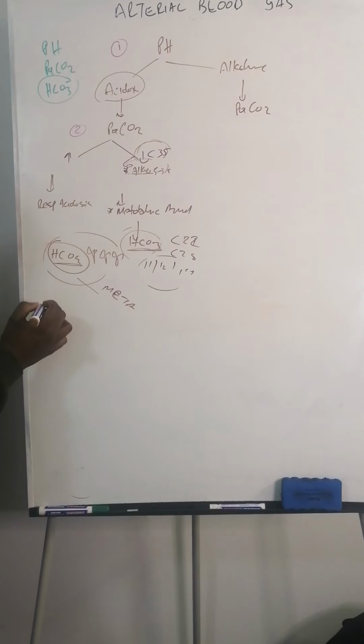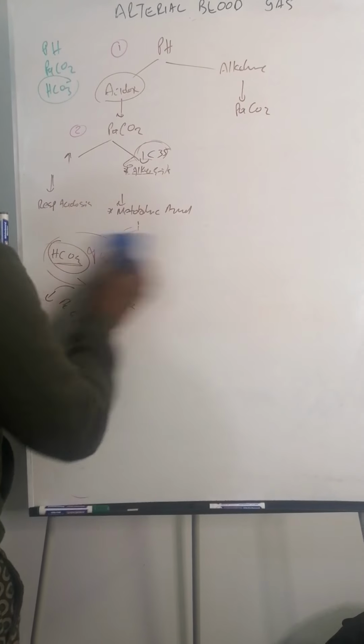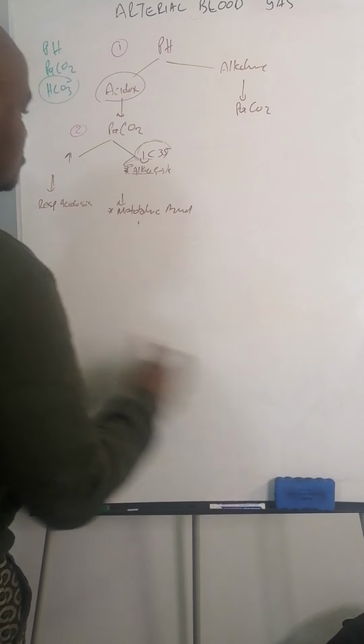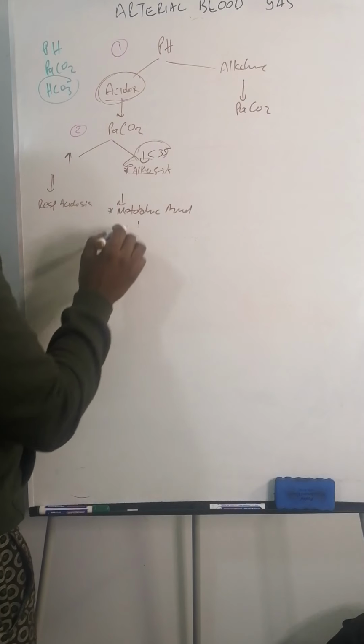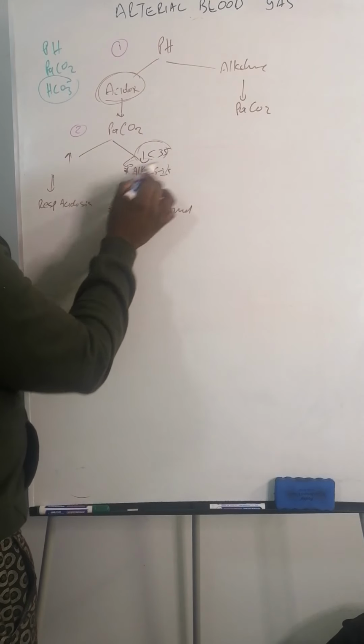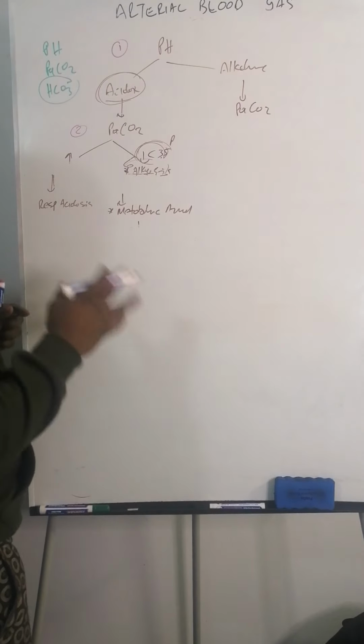But if you have a respiratory alkalosis, you've got a decreased partial pressure of CO2. So that's a difference. In this case, we've got an acidic patient. The pH is acidic, but we look here and see alkalosis according to the partial pressure of CO2. So the initial insult must be an acidic kind of insult, and it makes sense that it's metabolic acidosis.